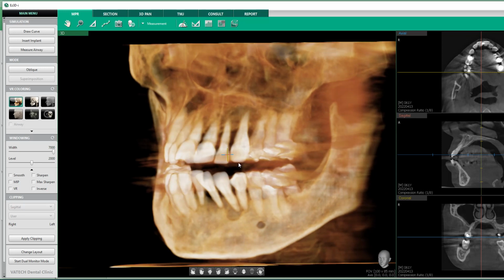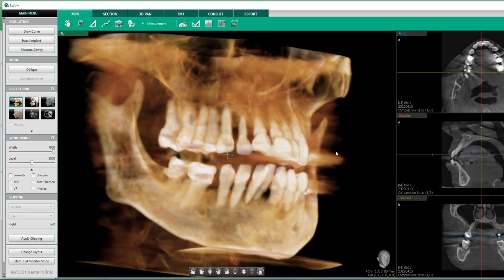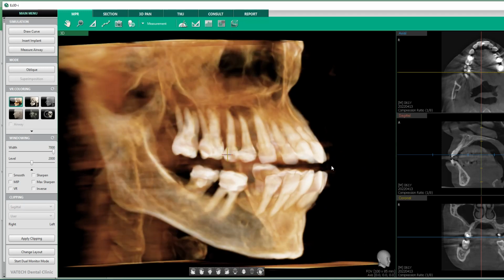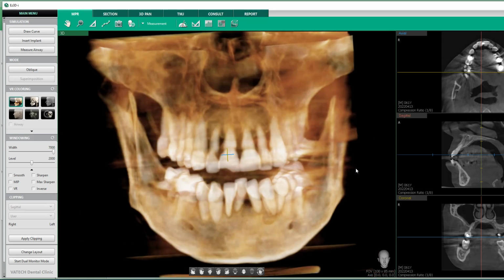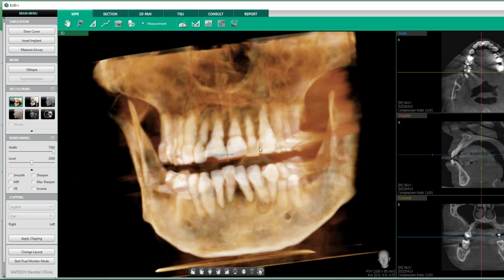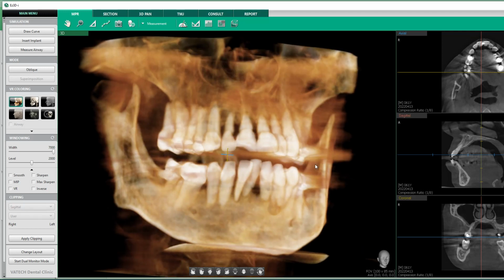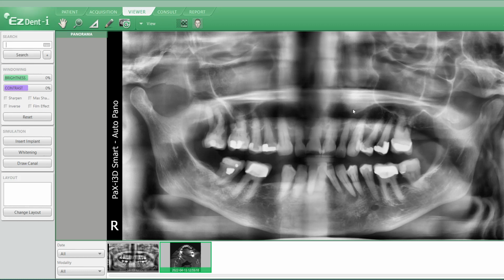But anyways, first thing we do when you come in on consultation day, we get a 3D scan on you. And I mentioned this on another one of my videos: if somebody is talking to you about an all-on-4 and they don't have a 3D scan, or they say they don't need it, just run. Literally. There's nothing to talk about anymore. Just run. They don't know what they're doing. Okay, so hopefully that was a good piece of advice. But anyways, this is a very critical piece of information that you need before you do any surgeries. And again, this is a traditional panoramic x-ray. This is helpful, but nothing nearly like a 3D scan.